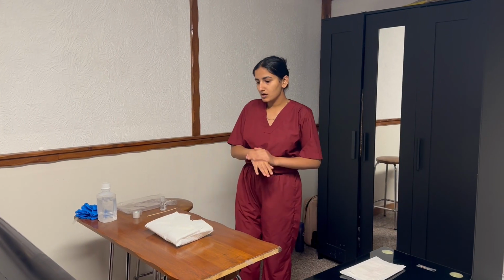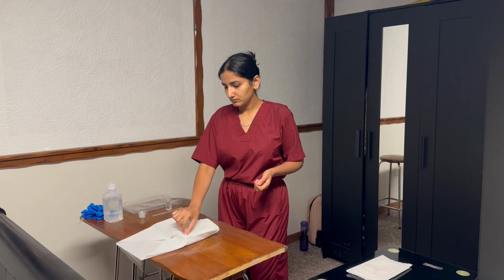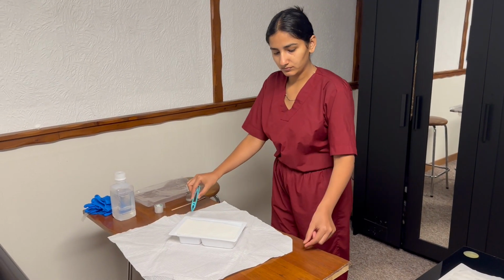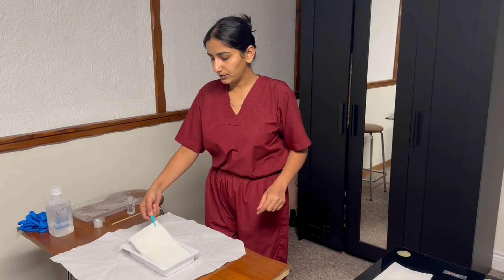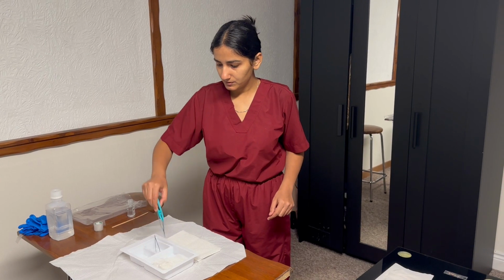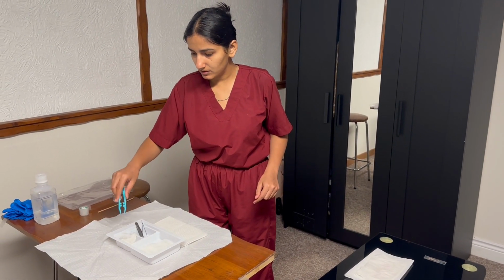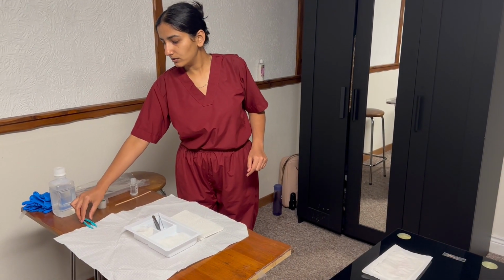To open the tray, I will open it away from myself while maintaining this 1-inch border here. And now I have these tongs, so I can readjust the tray. I will reposition my tray and manipulate the supplies. I have these forceps here and gauze pieces. I have enough gauze pieces, so I will not add any extra. And now I'm going to place these tongs here to maintain the 1-inch border.